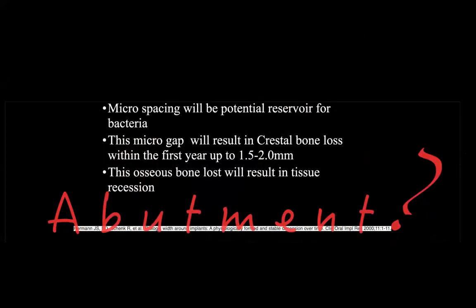One of the things that becomes a big issue on an implant is the microspacing that's created if the temporary is not a perfect fit to the body of the implant. If you have a plastic, that may create some microspacing in those areas, where it's a reservoir for bacteria. As a natural result, if you have this issue, you will end up with bone loss at the crest of bone, because that's the most sensitive part of the entire body of the implant and implant to bone contact.